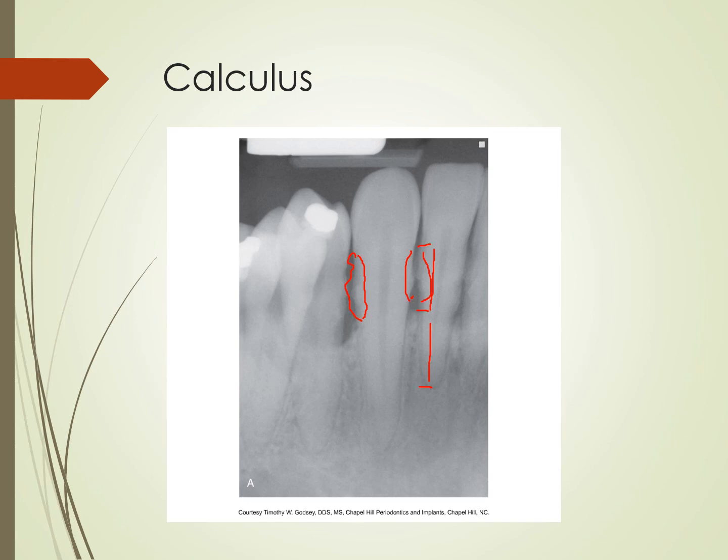It becomes very, very dense, and it adheres to the tooth so strongly that it is imperative that you learn in preclinic the angle of instrumentation, getting that 70 to 80 degrees of the blade right up against the tooth, so that you place your blade here and scrape it right off, and it pops off in little chunks. That's imperative, because otherwise you're just going to be sliding right past it, and you'll be burnishing it down for the next hygienist.